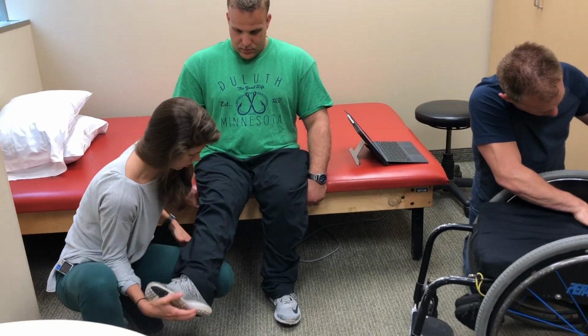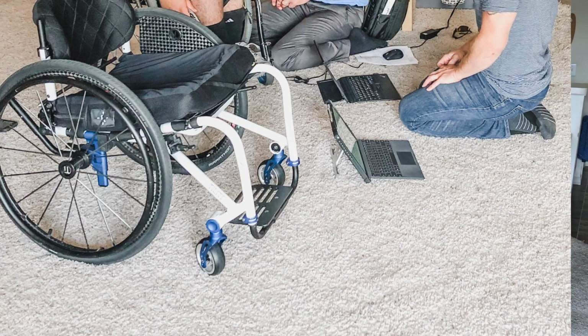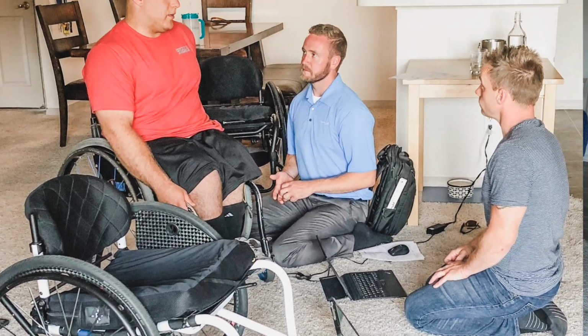All right, so we're about 2 months into the process now, and so the first step in that process was I met with the PM&R, and that was about 2 months ago. And then about 3 weeks ago, I did my appointment with the occupational therapist and the DME provider. And then today, we met with the DME provider and the rep from Tilite, and they fitted me, and we got all the specs that we want. And now the next step is them submitting that stuff. So I still don't have my chair. We're about 2 months in, and depending on how long that takes, insurance has 30 days to decide what they are and aren't going to pay for, and then we'll go from there and get the chair built.